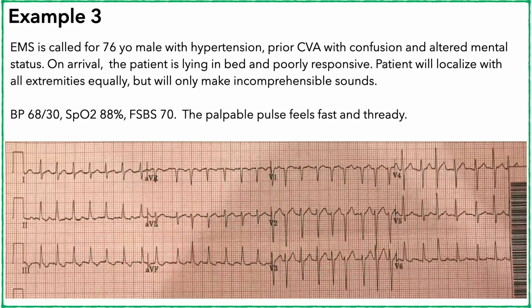I want them to sort of go ahead and picture what this patient looks like and then interpret the EKG.